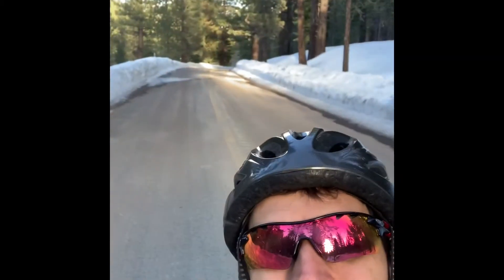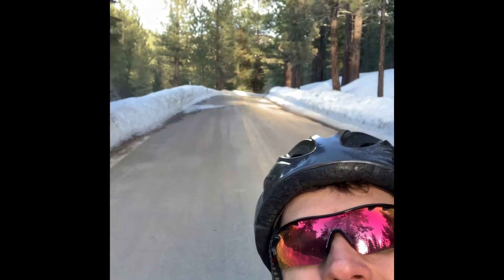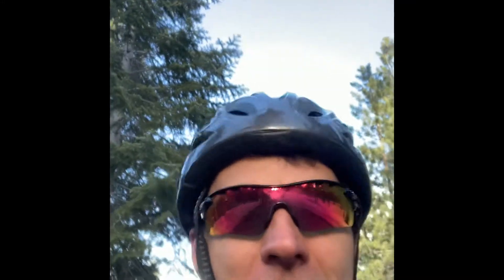Hey guys, happy President's Day 2022. I know it's been a while since I posted, but here I am going up Ebbets past beautiful snow-capped mountains — there's a little stream down there. The sun's going down so I better hurry, but I just felt inspired to make a video because I know it's been too long and I have a bunch of updates.